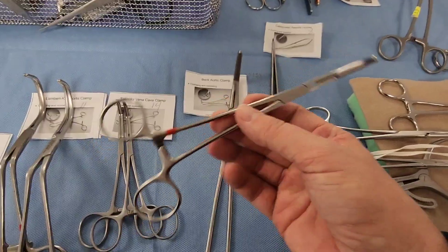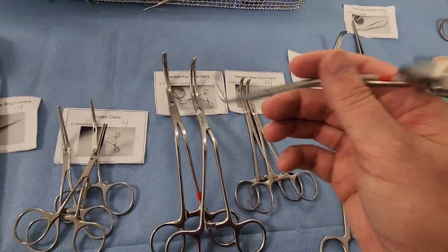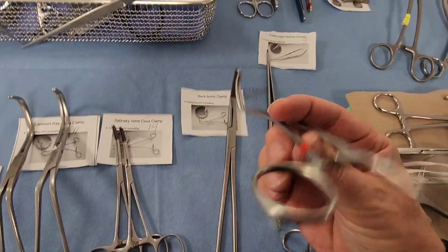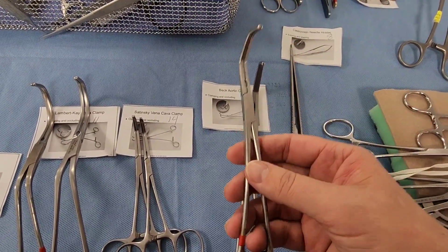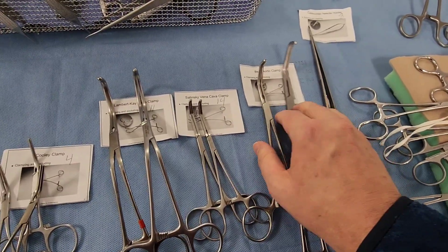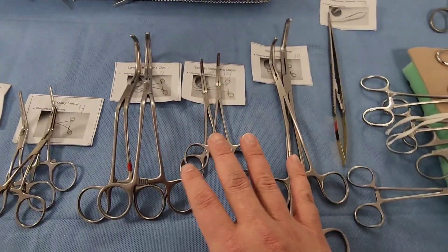In larger clamp sizes we have the Beck aortic clamp. It can be hard to distinguish these from each other — really, each is designed for a specific job, and doctors have preferences. Everyone's anatomy is a little different. The Beck aortic clamp is similar to the vena cava clamp but a bit bigger, designed for larger arteries — especially the aorta.